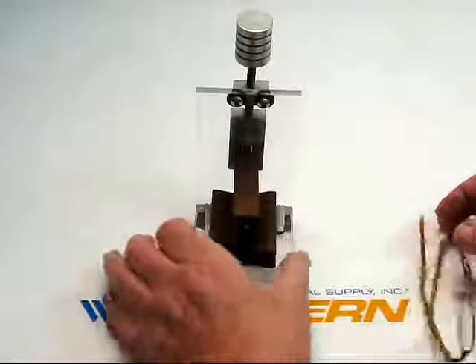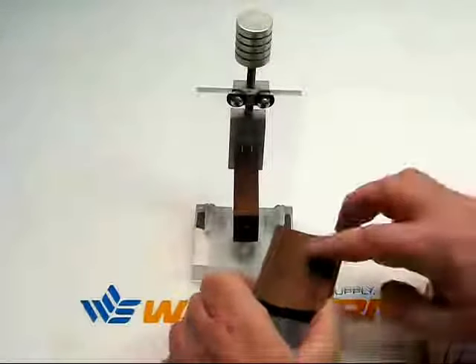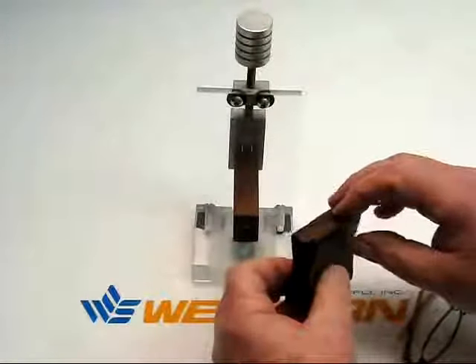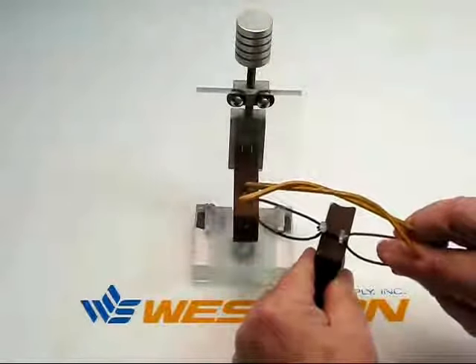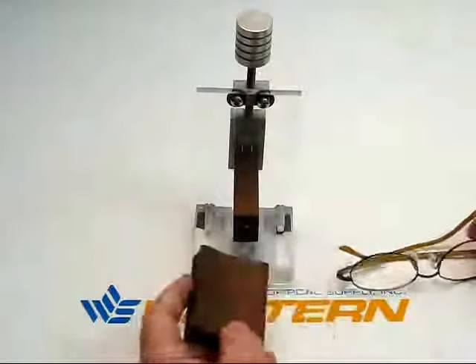And that's what this device does. It has two blocks that you're going to wind up pressing the eye wire between. The curve on one side is a 6 base, the curve on the other side is a 9 base, and the curves on the ends of the blocks are used to shrink the bridge — to bring the PD in more, or to get a better fit for your patient.